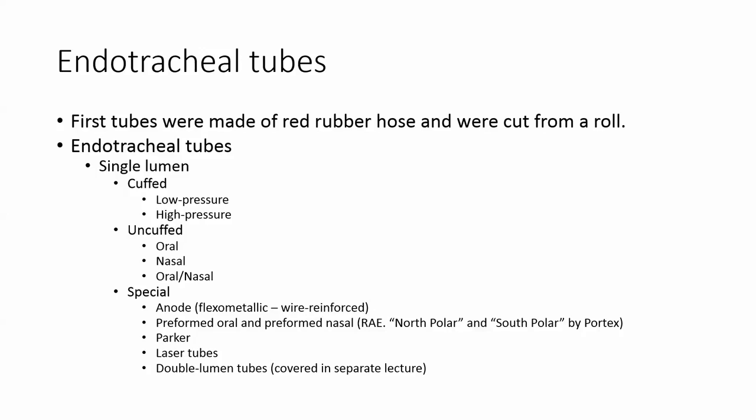So even though you're used to putting in endotracheal tubes on a regular basis, when you come across a special tube, you might well want to read the instructions for use, because they may well be different and separate, special.